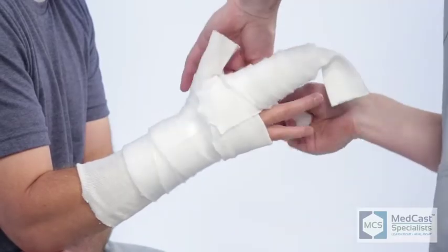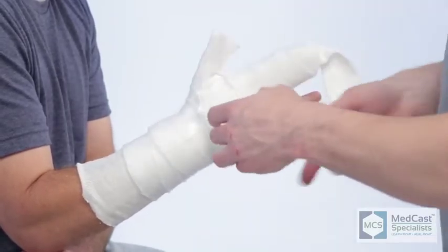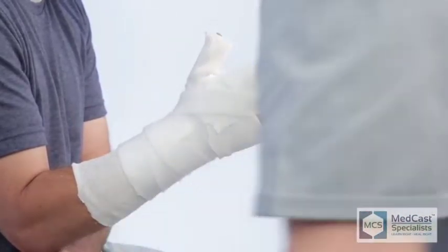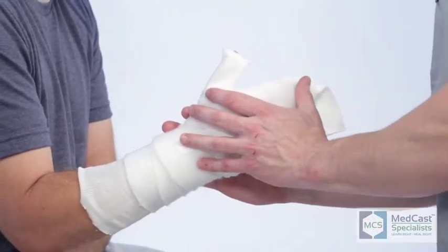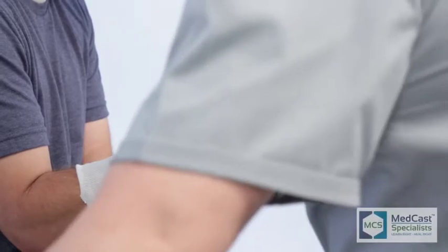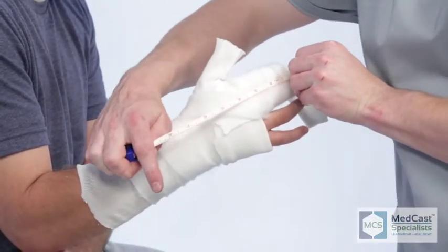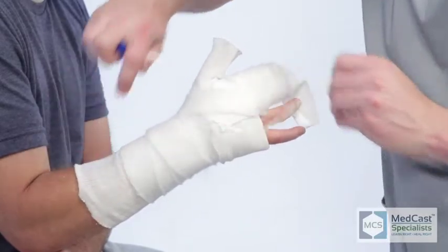So for this cast where we're casting the second and third digits, we want to avoid any excess bulk between the third and fourth fingers. So we're going to show you how to reinforce it here so you don't have to use as much cast material, and it makes a much better experience so the patient can keep their range of motion in their exposed fingers and not rub on the fiberglass.